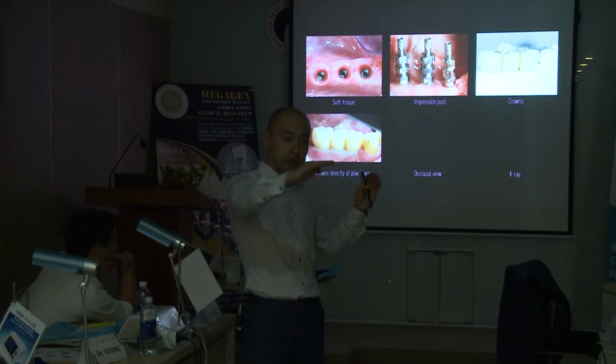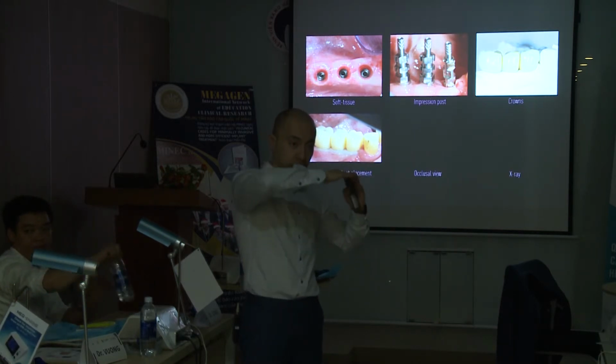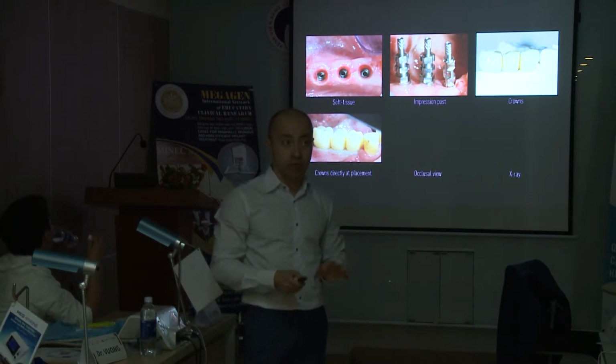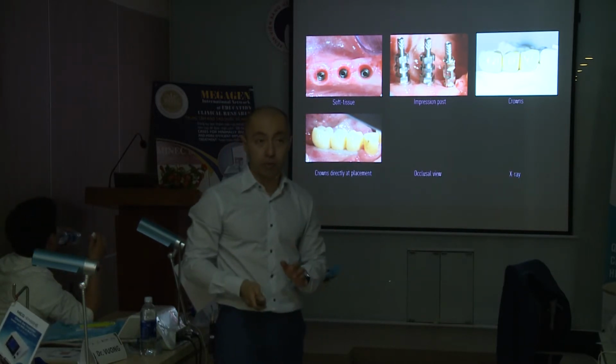Just as long as the span is not too big, because otherwise it can move. I always go for single crowns. If something happens with one, I will treat the problem.